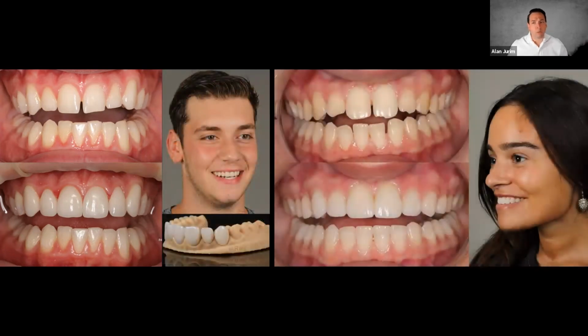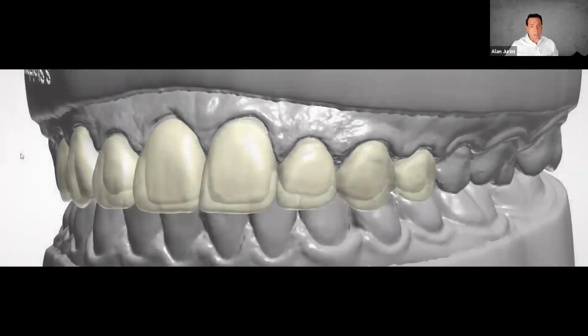So another case like what we see here, where we're going to create veneers on a patient like this. This is the end result, but we generate models throughout the process of actually creating the smile. And this is a really good tip if you are working with a laboratory where you have tackled the input part of digital dentistry: you take digital scans, you send them to your laboratory, they print the models, they do the final output, and then they send you back the units to deliver.